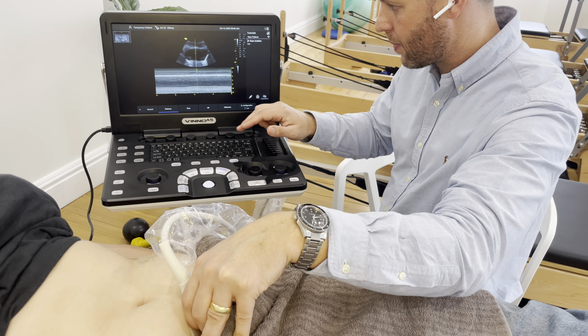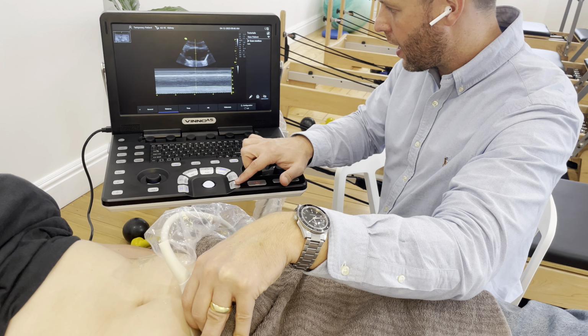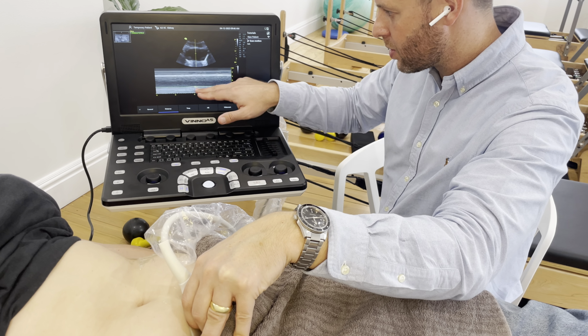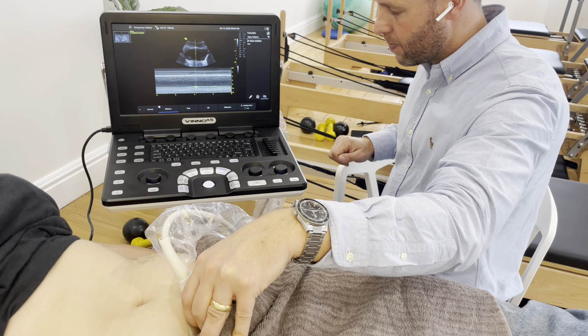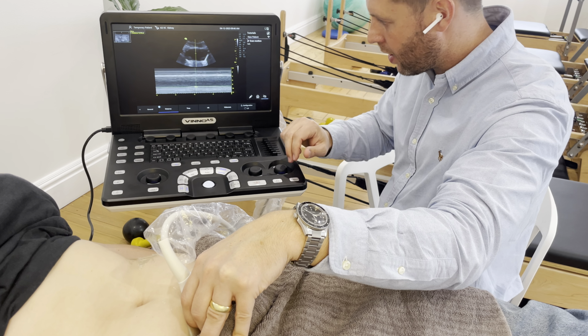So I can press measure. I can come down to this line here and press enter for a distance. And then I'm going to bring the line up to as high as it went. It went 0.34 centimeters. So a very, very small contraction. You can see where the green line is compared to where the white line is.